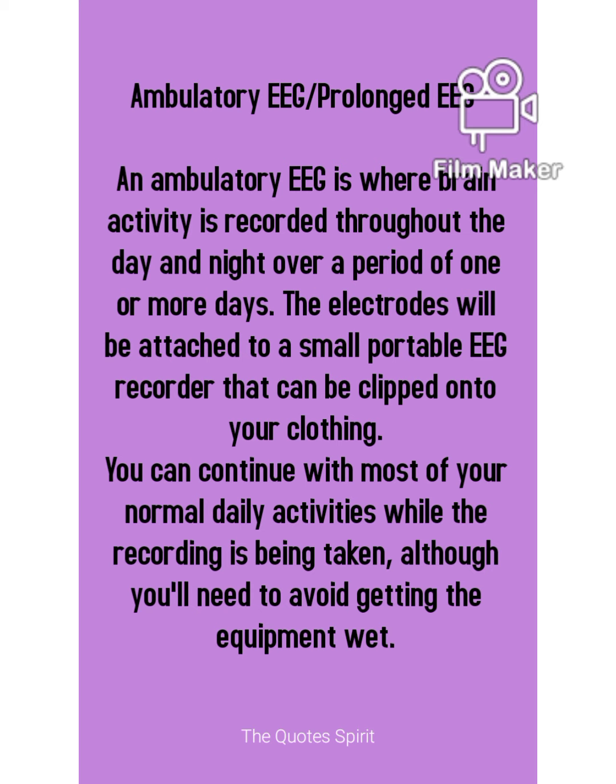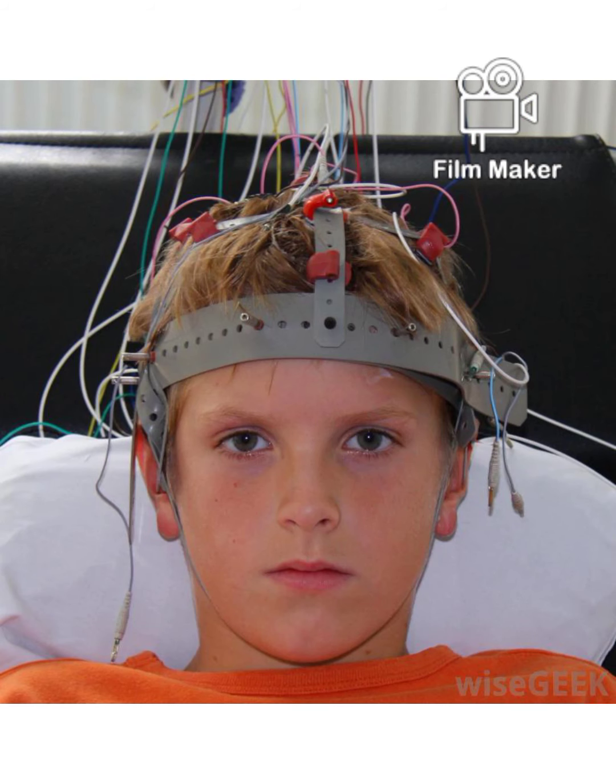You just have to take care that the equipment recording your brain activity does not get wet, so you should not be in contact with water often.